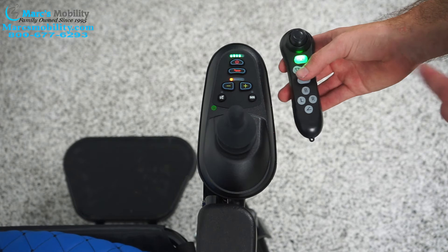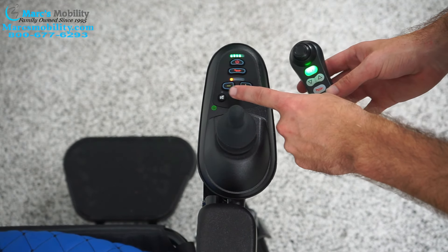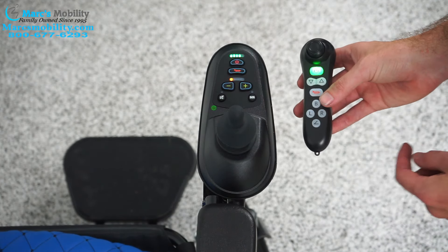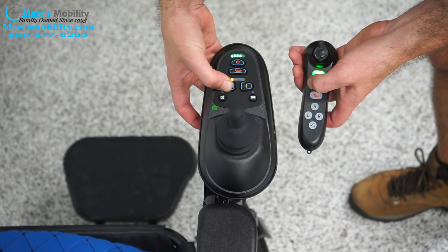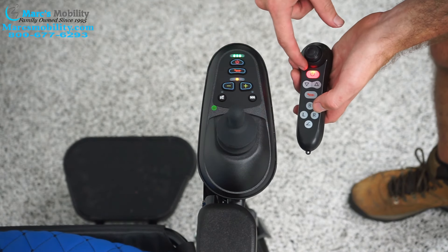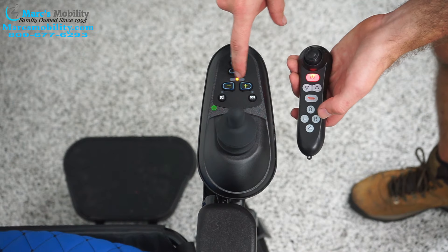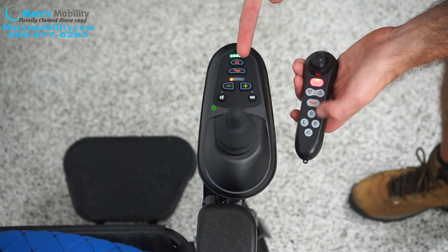Next, in order to pair them, we're going to have to hold the minus button on the joystick and the remote at the same time. You'll have a red light up here, and you'll have a single amber light in the center of the joystick. You have to do it within a few seconds though.